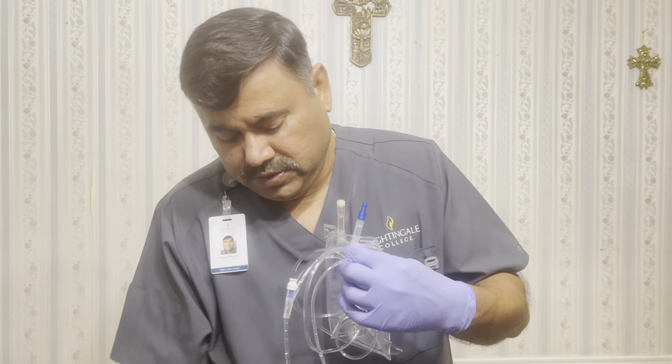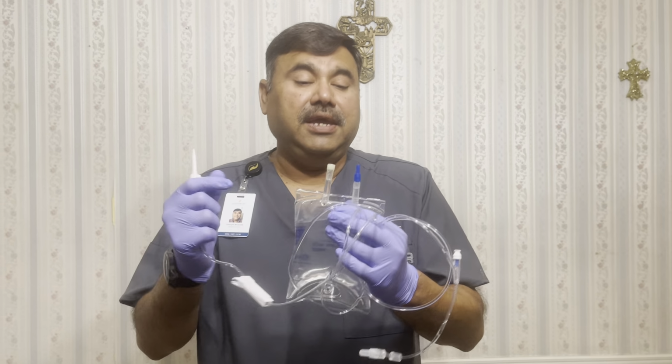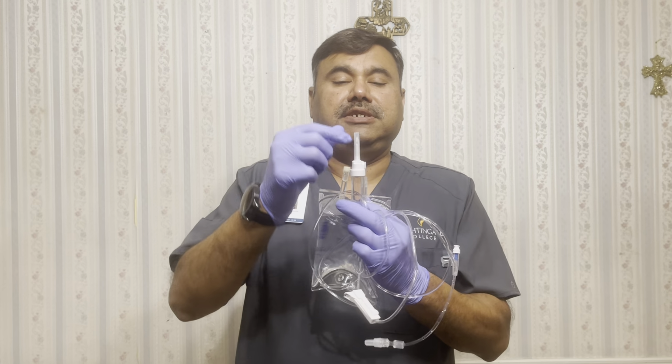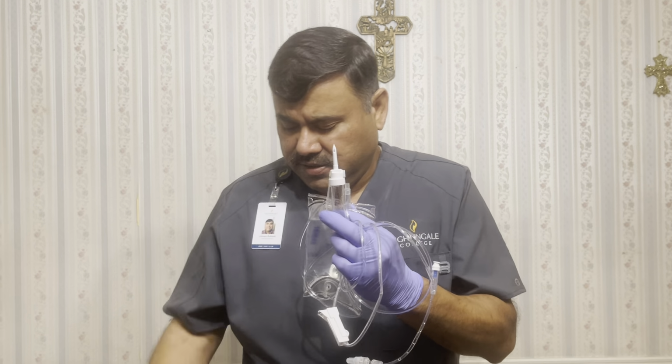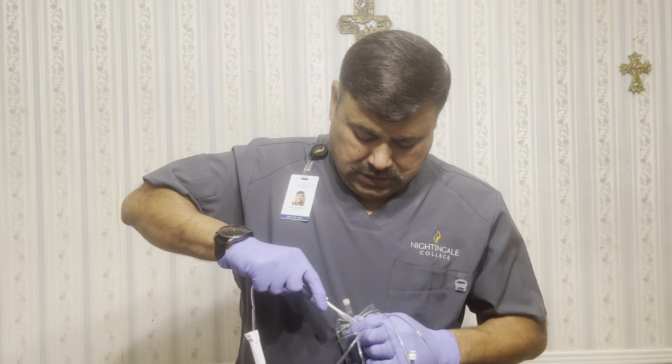All right, let's start. So here's my first bag. I'm just going to choose it. Before starting, I will take off the cap of my fluids and put it down, and then I'll take off the cover of the spike and push it all the way to the end.